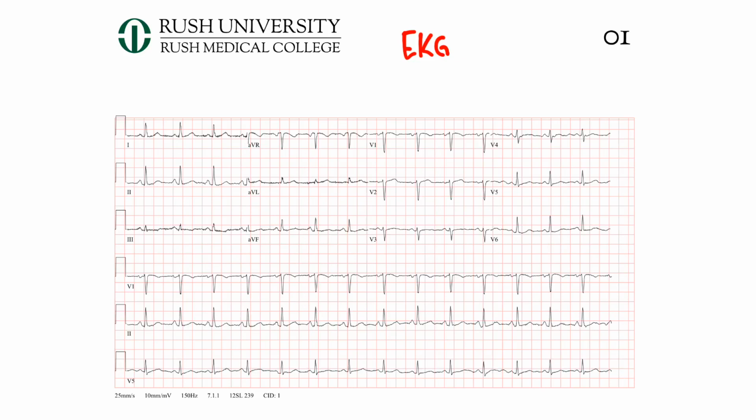Now, this is a lifelong journey to learn how to read these things well. And so we're not going to perfect it now. We're going to go over the basics, but you can learn a lot just today. But over the course of your career, you're going to learn a lot more.